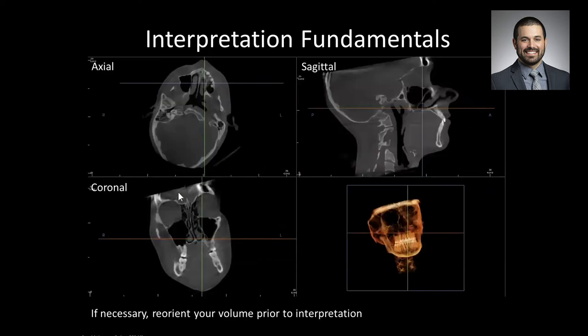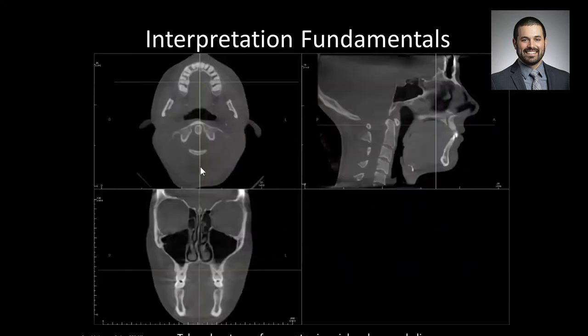If your patient was scanned in a machine crooked, which sometimes happens, use the tools in your software to reorient them. You can basically turn on some tools and rotate this patient back, so instead of scanning obliquely or cutting obliquely through them, you set them up like this. So the image you view will match your mental map of what anatomy is there, with that symmetry built in.